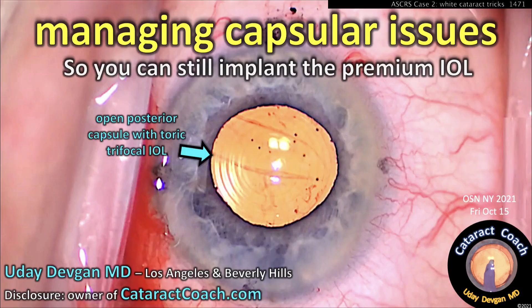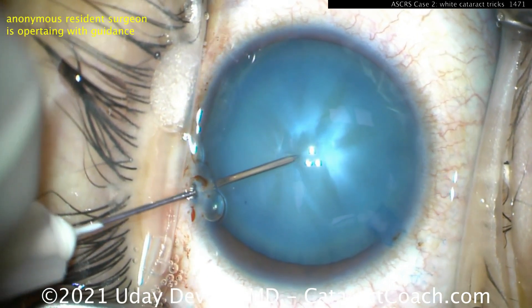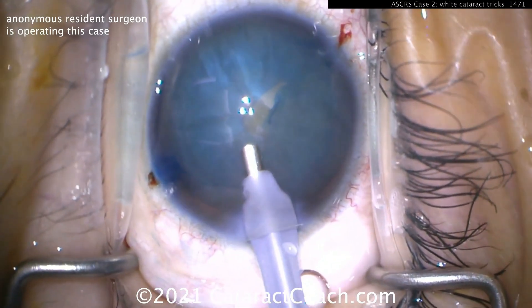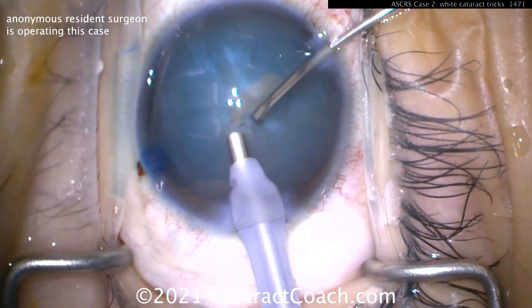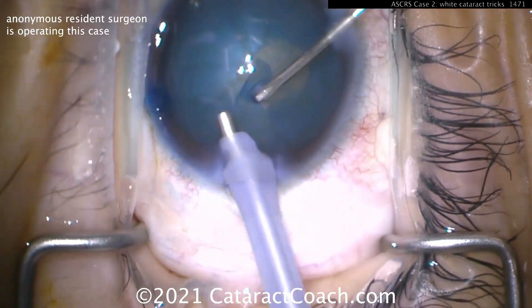Let me show you this — here's managing some capsular issues. We've all seen this before: you go inside and wow, the capsule splits in a second and now you've got a tough situation. Here's a case where a resident is solving this by buzzing with a phaco probe, creating an opening, keeping the probe in the eye at a very high infusion pressure — 80 millimeters, 90 millimeters of mercury, et cetera.